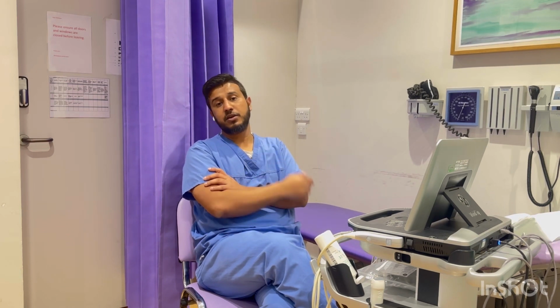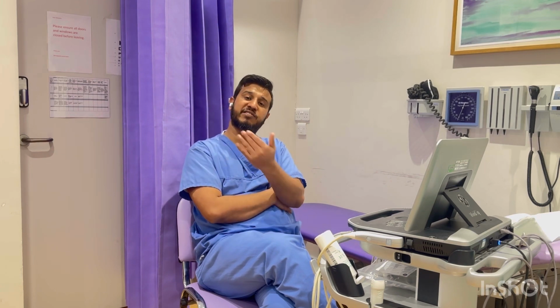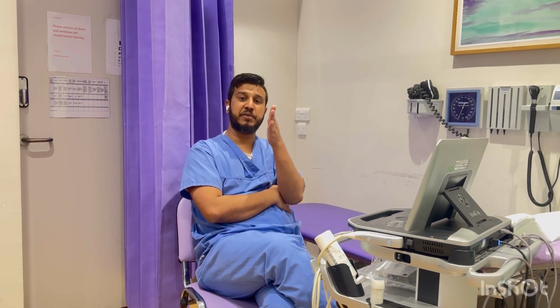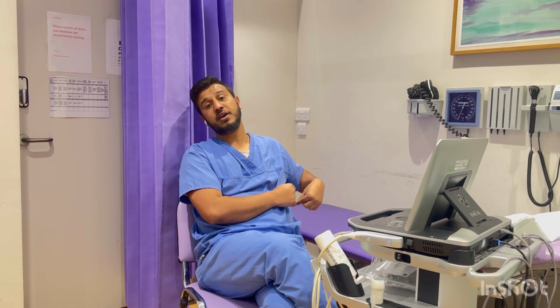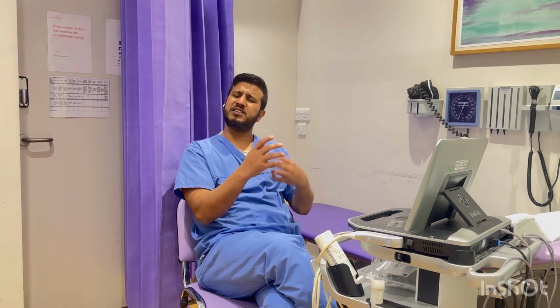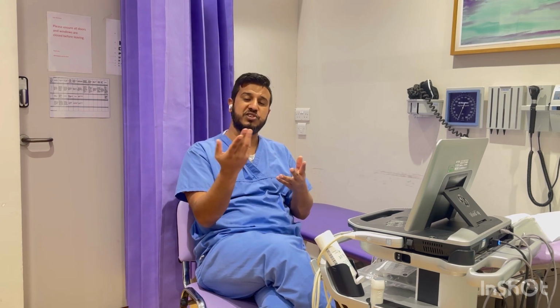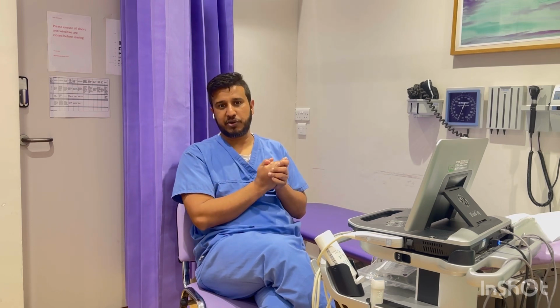Then you go on to your apical views, and in apical views there are subviews, for example, apical 4 chamber, apical 3 chamber, apical 2 chamber, apical 5 chamber. These are the different images which you are going to take on the apical views. Then you go to the subcostal views. In subcostal you can take mostly all the images, but mainly you are going to see the interatrial septum, and then the IVC and abdominal aorta.